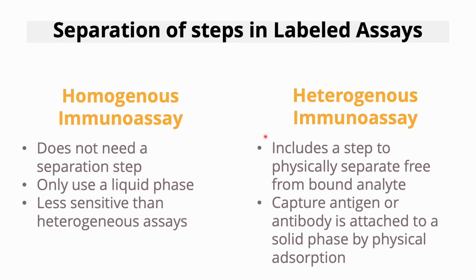Next, we have the heterogeneous immunoassay. These kinds of tests include a step to physically separate free from bound analytes. These are what are known as washing steps. Heterogeneous immunoassays usually employ capture antigens or antibodies that are attached to the solid phase by physical adsorption.